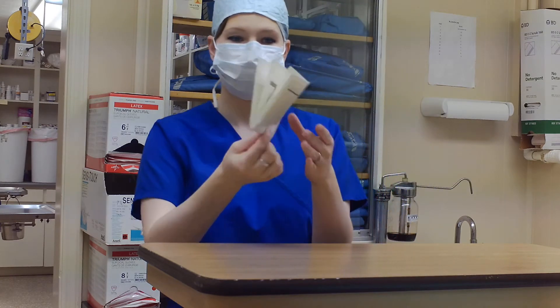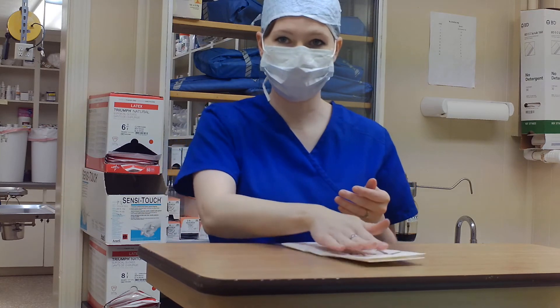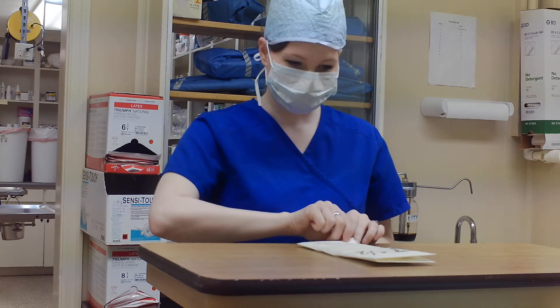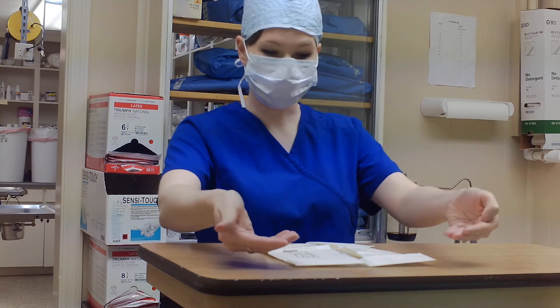So these are gloves. Essentially what I'm going to do is open it up flat onto the table. I'm going to open it up because it is closed kind of like a book. I'm just going to open it up flat. And then there are little pieces of paper that hold the gloves and are folded over to keep it sterile.